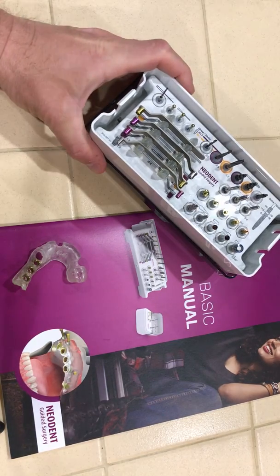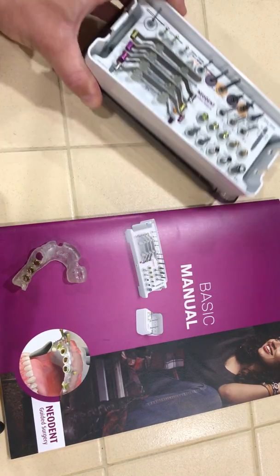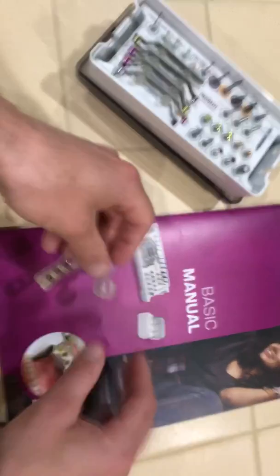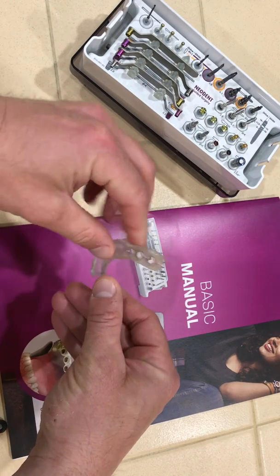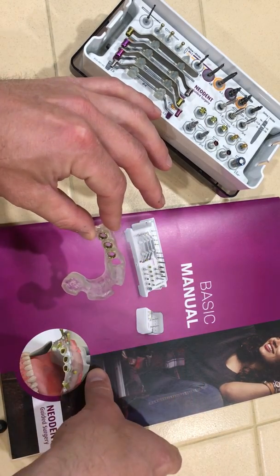Good morning! We're going over the Neodent Guided Surgery Kit today. Here's our manual — this thing is fantastic. It gives you all the information you need, including specs for the laboratories as well as the doctors.